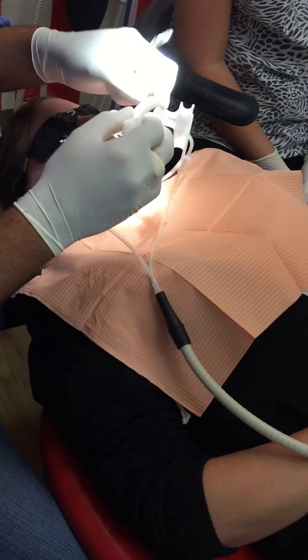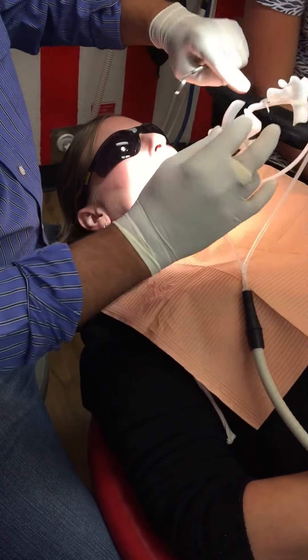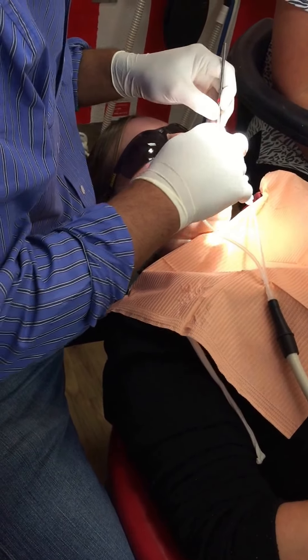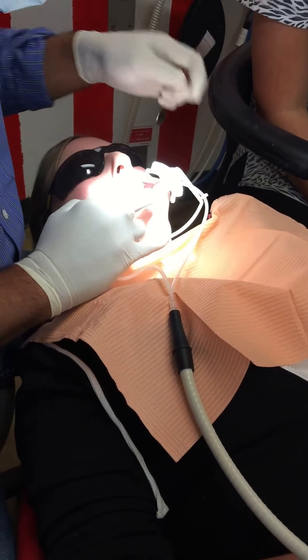We've just pumice cleaned the teeth and rinsed. Now we're going to put the dry field in. This is connected up to the low volume suction, with little adjustments here and here.